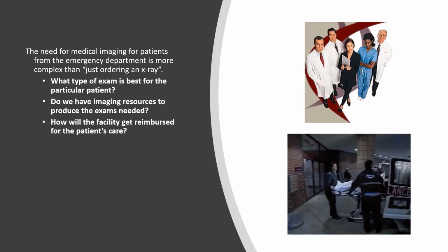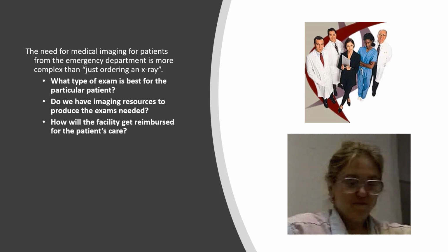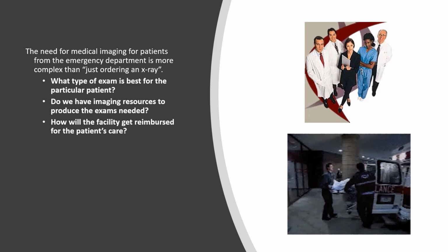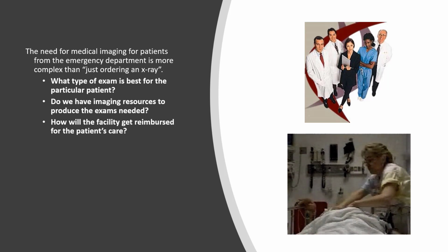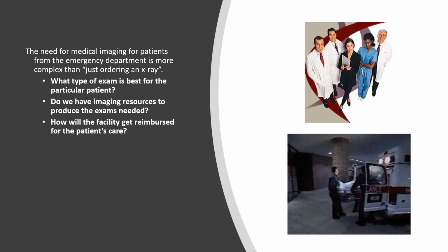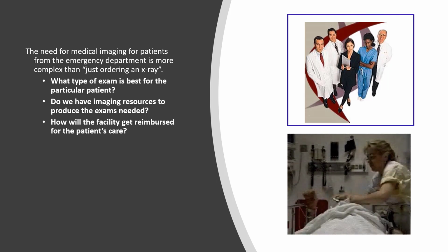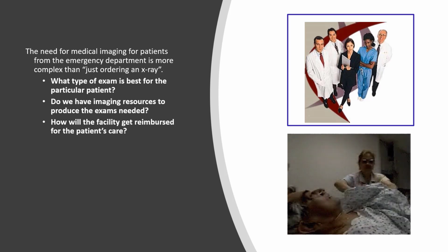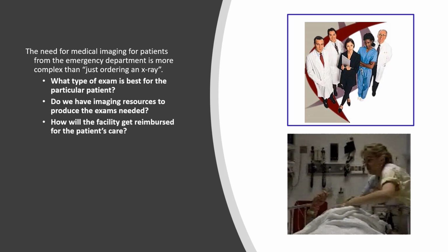Now, realistically, in the emergency department, they need to write a new prescription or imaging order for that. Of course, they don't want to do that. It is illegal for you as an x-ray radiographer to take the original order and change the right to left. So you need to really get together with the folks and start working as a team and exchanging the things that need to be done correctly between the two of you so that you can get the exams done quickly and correctly.